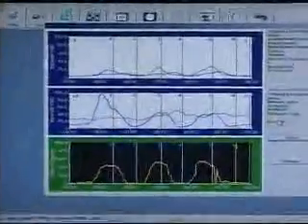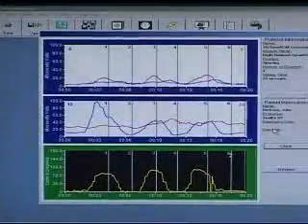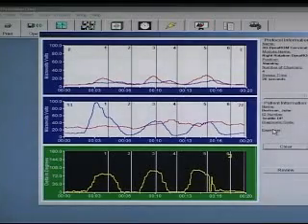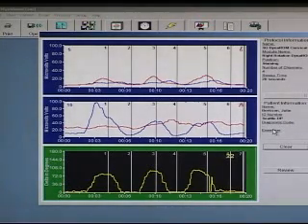You can hit clear to redo a screen, and the other thing to remember is that in flexions and extensions you're marking at the lowest level of muscle tension, so you're measuring at the valleys, and in lateral flexions and rotations you're marking at peaks and valleys in terms of muscle activity. And again, you can always hit clear.